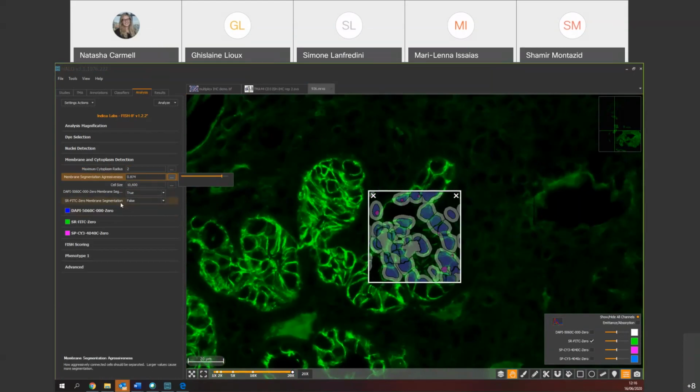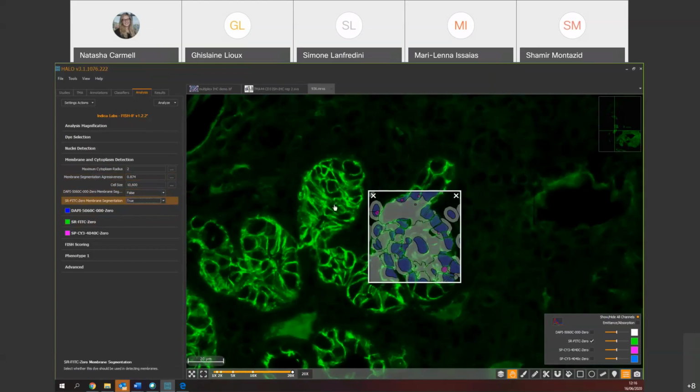Sorry if I interrupt, but is it not fixed? It should be true. And okay, excellent. Sorry about that. Thank you for this. It's good, I know that you're learning. All right. So this is typical. Just make sure that you choose the right one. I was finding it very strange that it was not picking it up, but exactly, you spotted this correctly. Yes, I didn't select the right one at the start. All right, this is much better. All right.